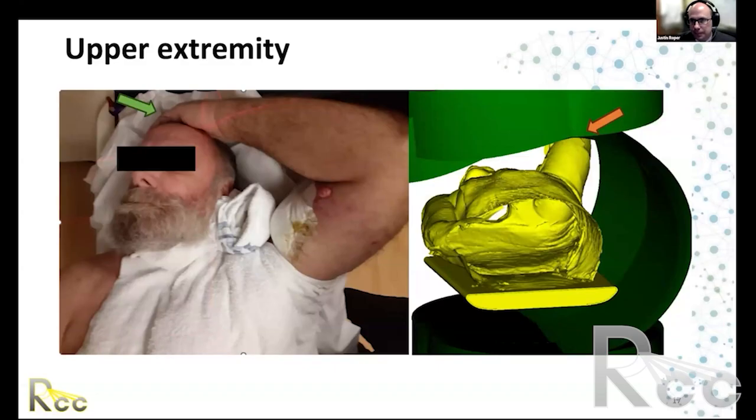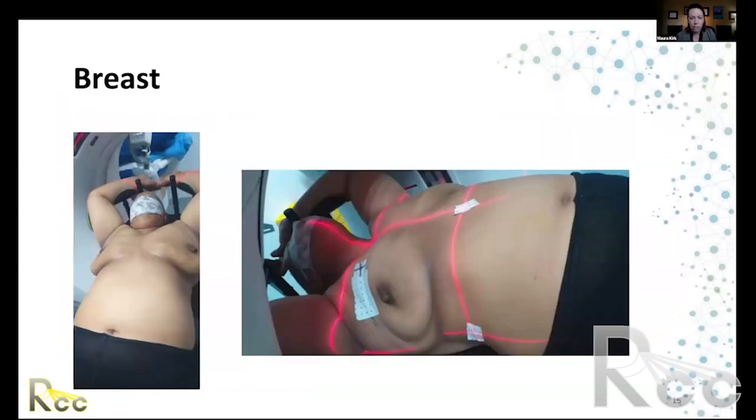Thank you. One thing that came to my mind with these breast simulations that I did not see: I think it's somewhat common in the facilities I've worked at for the physicians to put wires or marks at the end of the palpable breast tissue. Sometimes in the CT simulation, it's hard to determine where the fields should end. So it is somewhat common for the physician to put either wires or BB marks to mark out on the patient at simulation where they would want their breast fields to end. And that can help you in setting up your tangent fields in the treatment planning system.